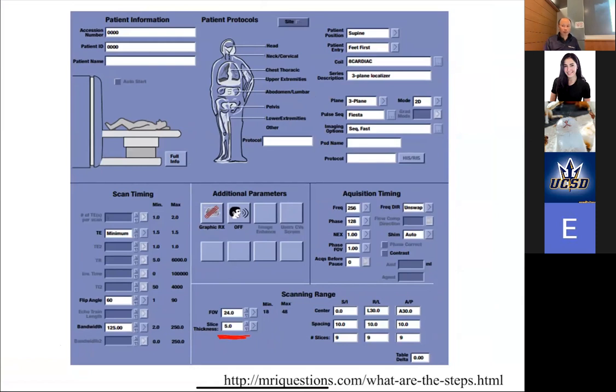because it is one of the fundamental features of any MRI exam, which is in MRI, the basic imaging we can do is either 2D imaging, where we do one slice at a time, we excite a slice, we reconstruct it, we do another slice, and then we reconstruct it. So that's called 2D imaging, and that is still done quite a lot in clinical imaging. And that's basically what we talked about. We mostly talked about 2D Fourier transforms. But the other scanning you could do is a full 3D Fourier transform, right? You could acquire KX, KY, and KZ, reconstruct that, and do a 3D transform. So that has advantages and disadvantages.